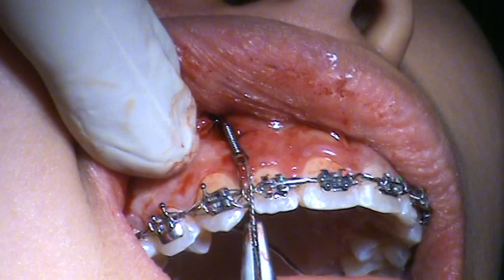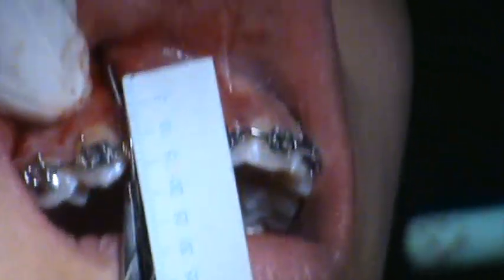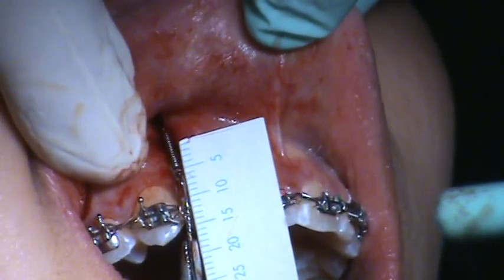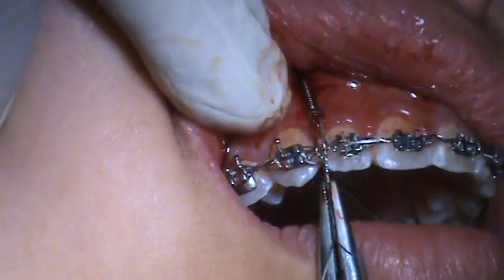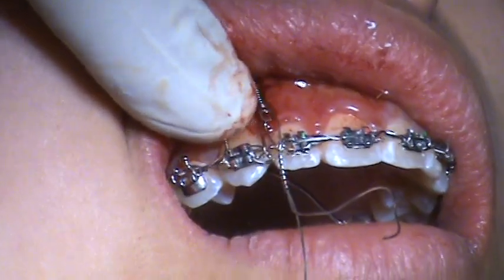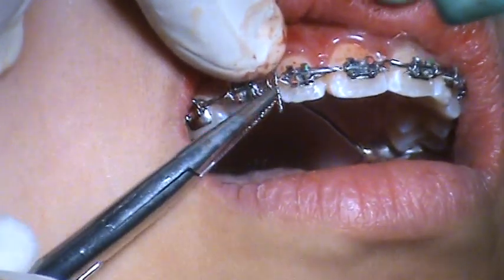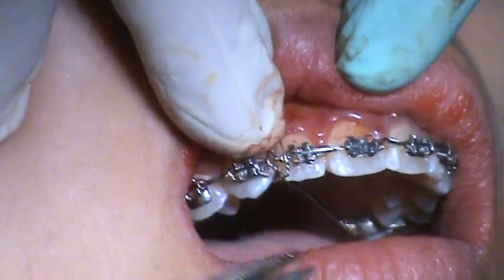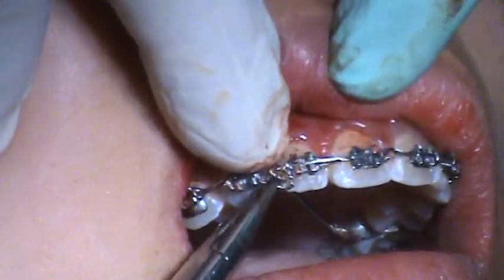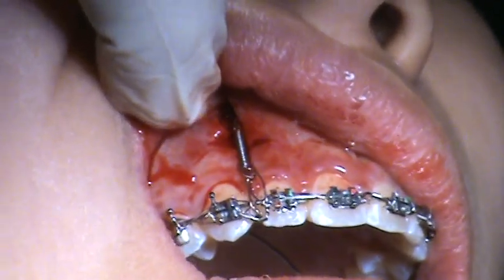That's about a 5 millimeter activation — maybe a 6 millimeter activation. Let's not do any more than that. We'll keep a wand again in case we need it, to move somewhere. Let me see about closing this — I'm not sure if that vertical is the best access, everything considered. I'll need some suture.